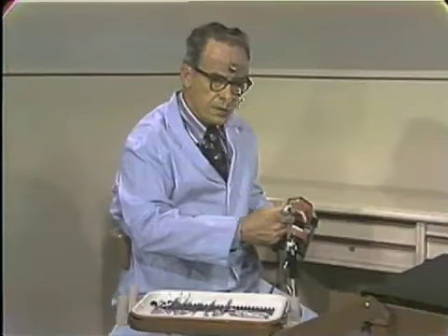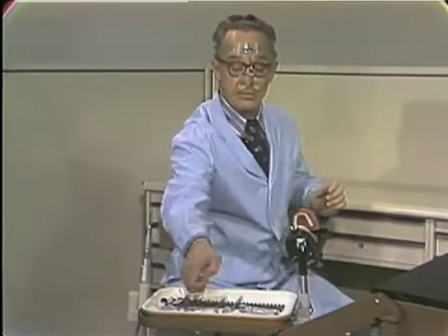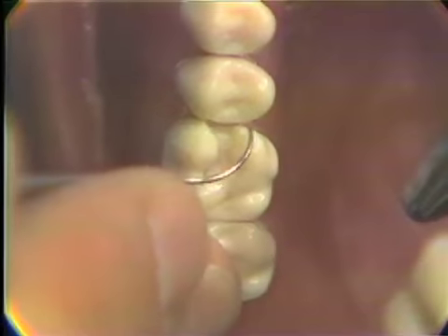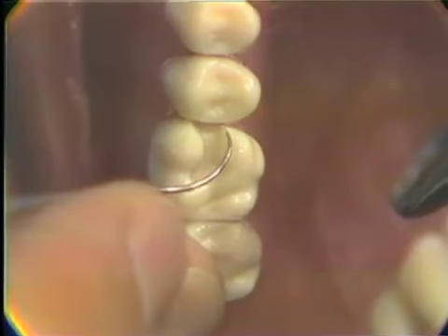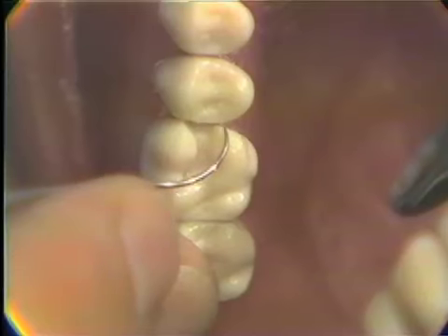From what we have just learned, it is now necessary for us to go back and re-examine the cavity. In doing this, we will change the position of the patient so that we can work with hand instruments if necessary. We'll first examine it with our Explorer. As you notice, the lingual wall was free for our disc, but it has very little flare. Now, we've talked about the importance of flare, so we will have to enhance our flare.